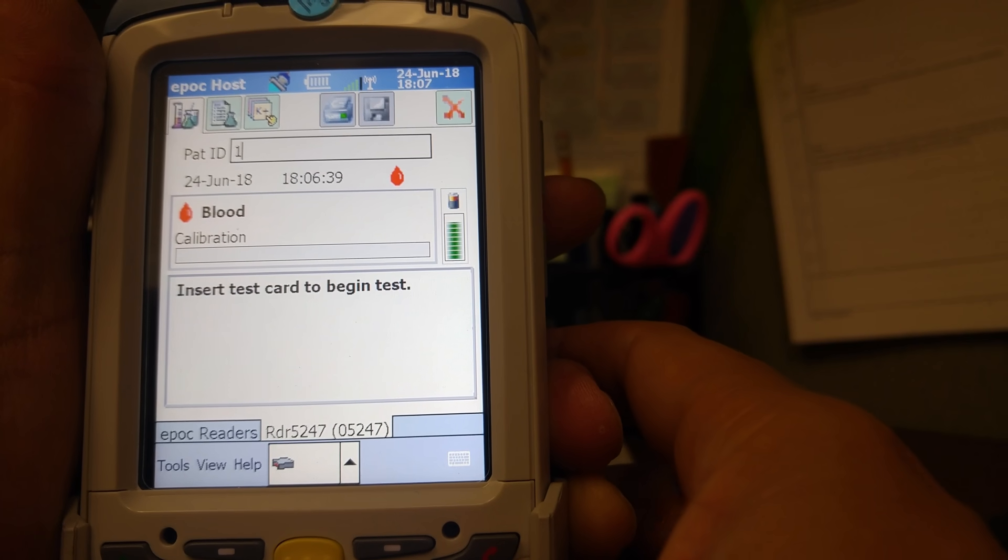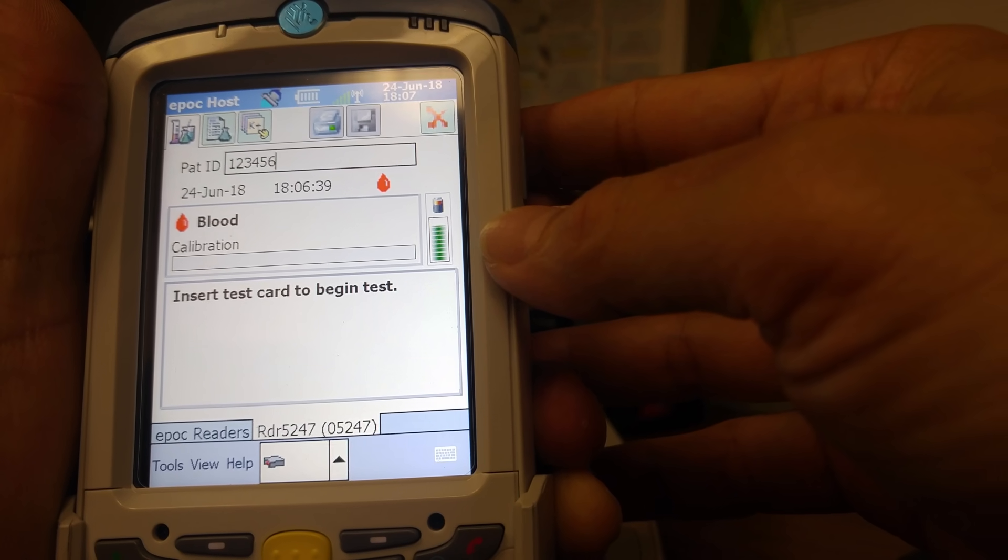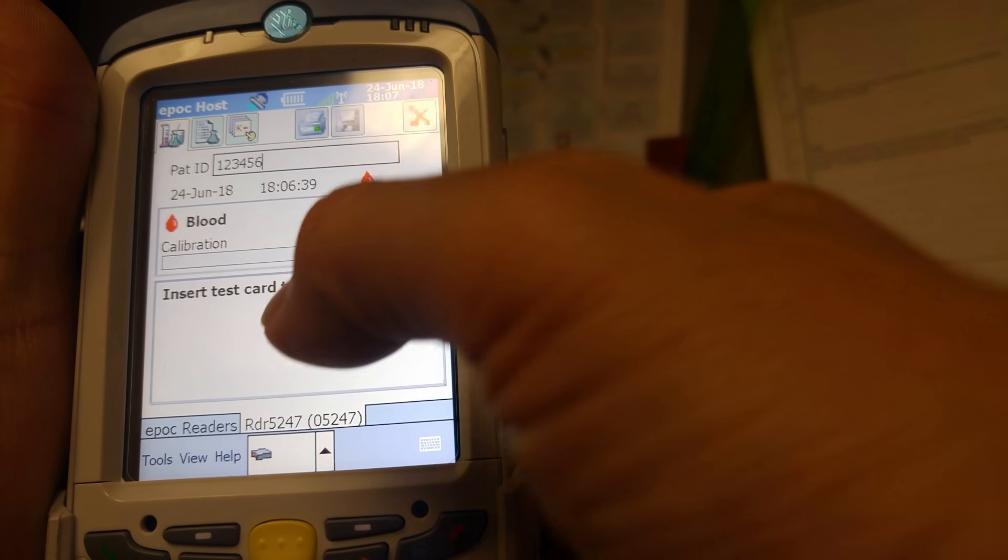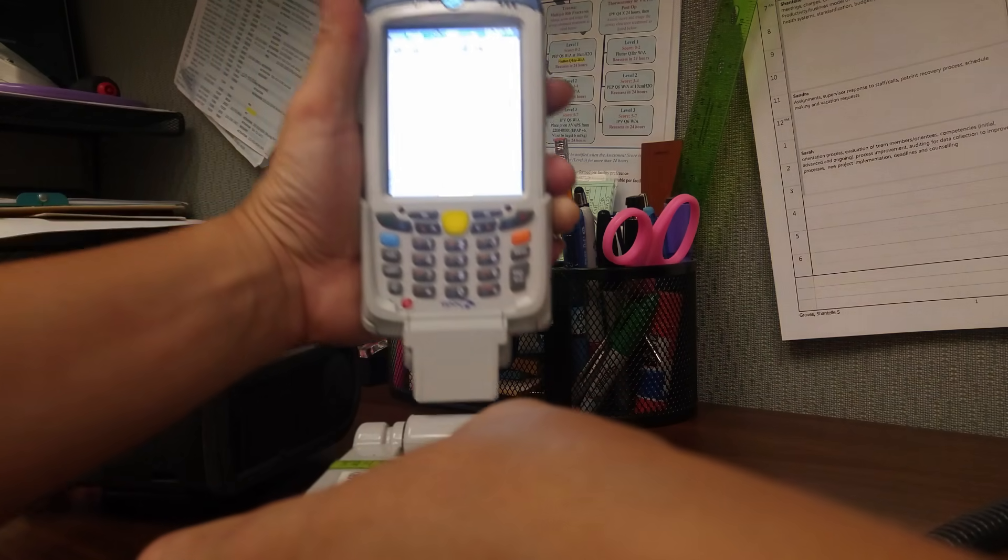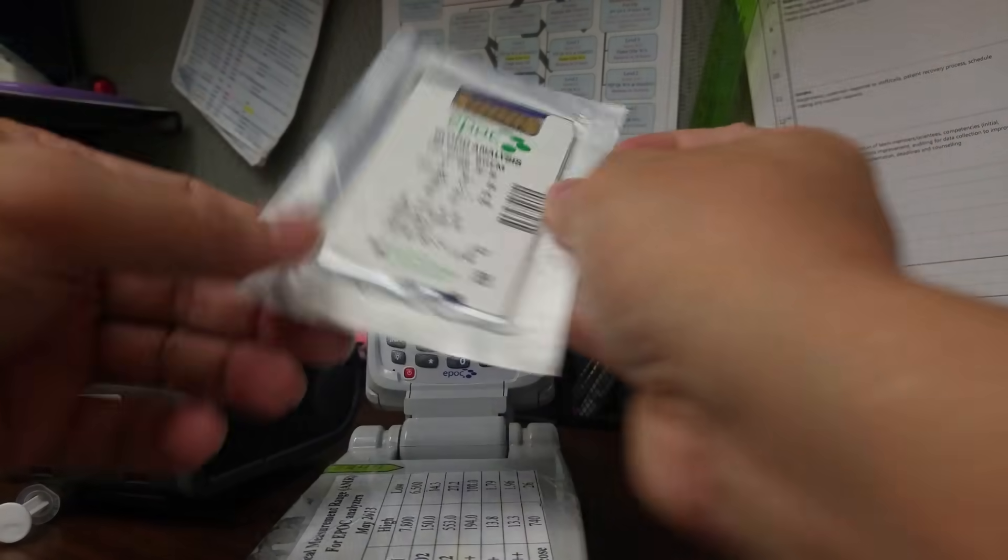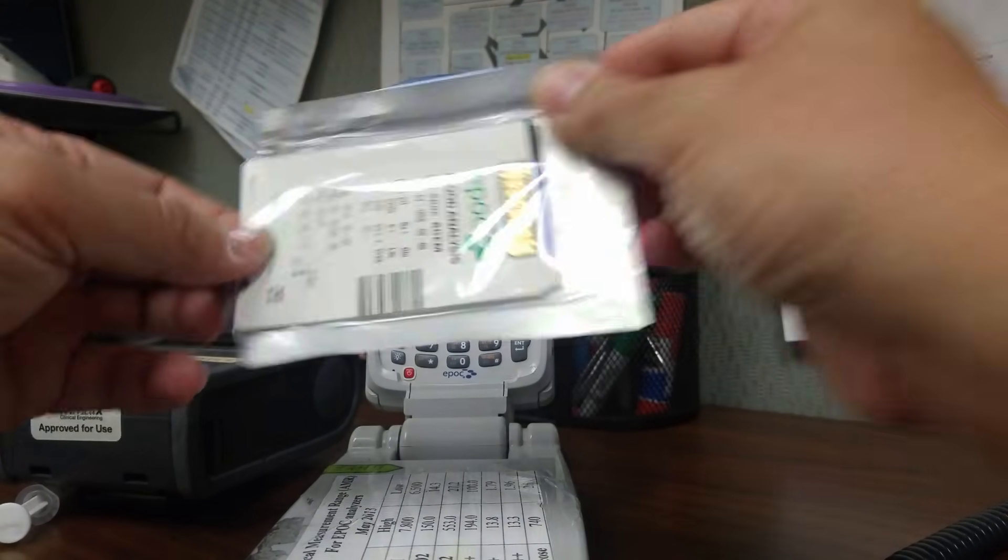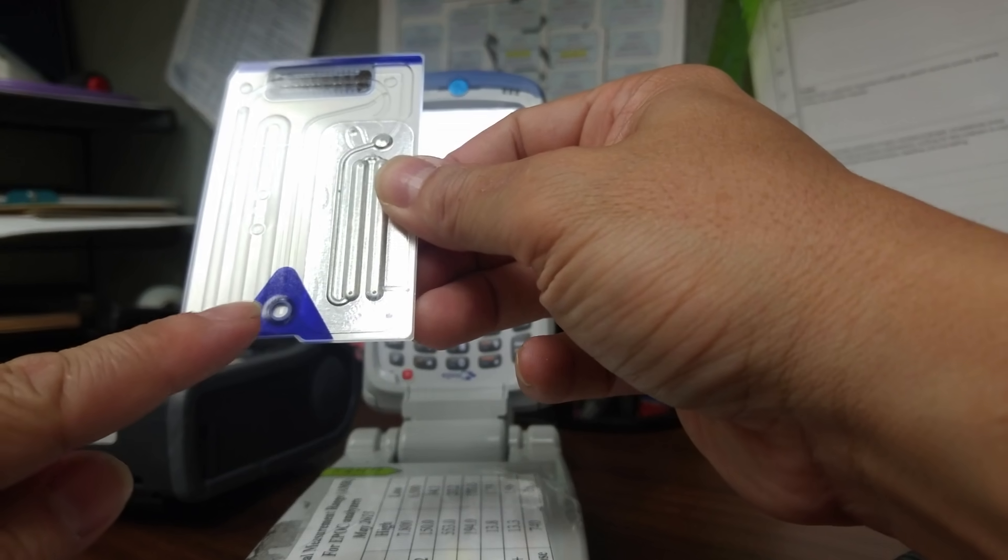You've got to get a card out. This is a card, the EPOC card. So get one out. You want to turn it around. This is where you're going to put the sample.